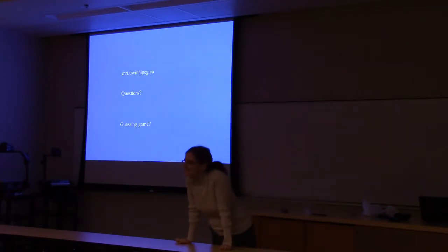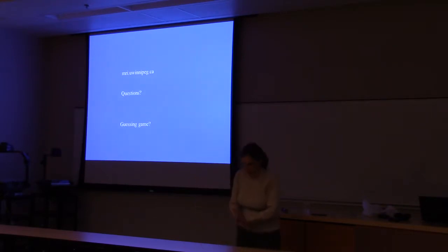As soon as you are doing this in frequency domain, what is your way to determine basically the frequency range? Because as soon as you have to go from frequency domain to space domain, the resolution you will get in space domain depends on the frequency range. What is the criteria for that in MRI?